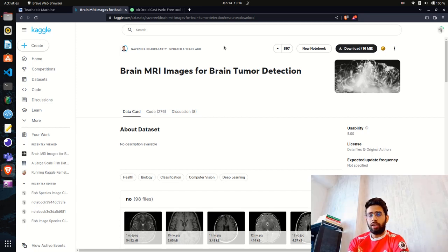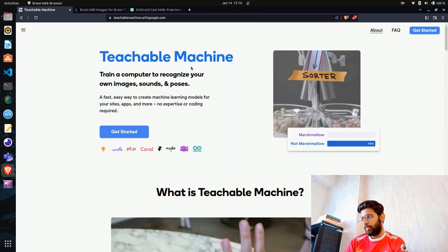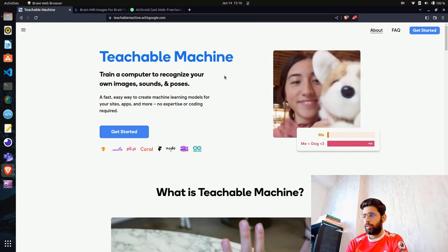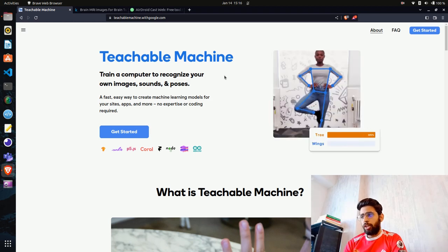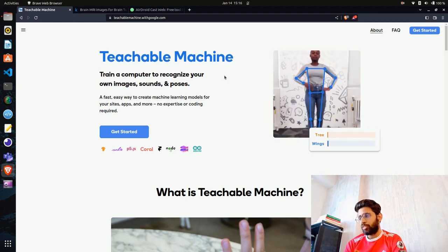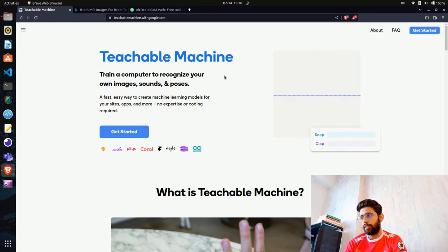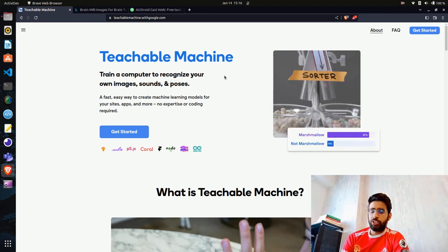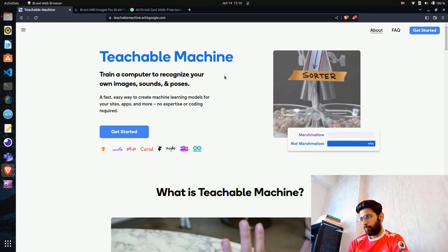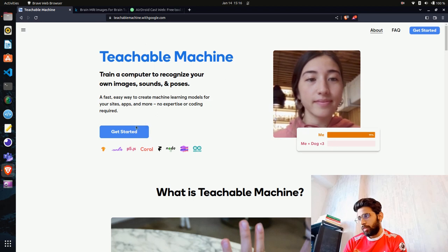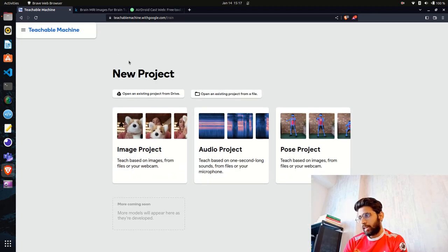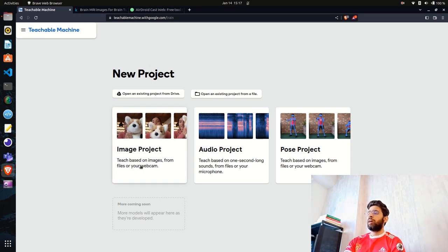We'll use the no-code low-code platform Teachable Machine by Google. It provides functionality to train deep learning and machine learning models for different tasks. It can handle different types of data — images, video, sounds, audio, and more. When you click 'Get Started,' you'll see three major categories: image project, audio project, or pose project.